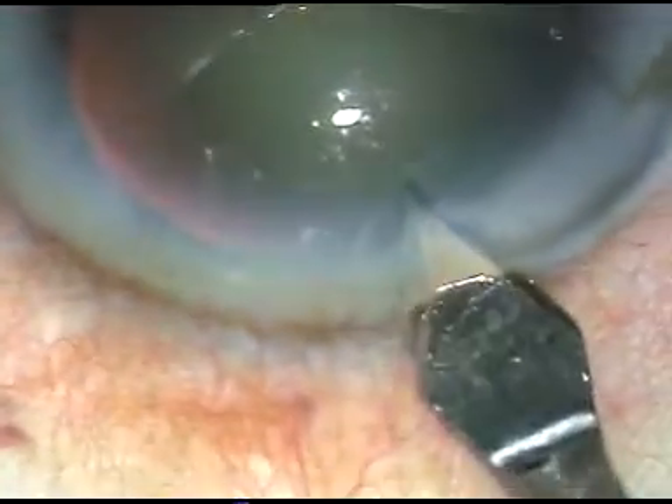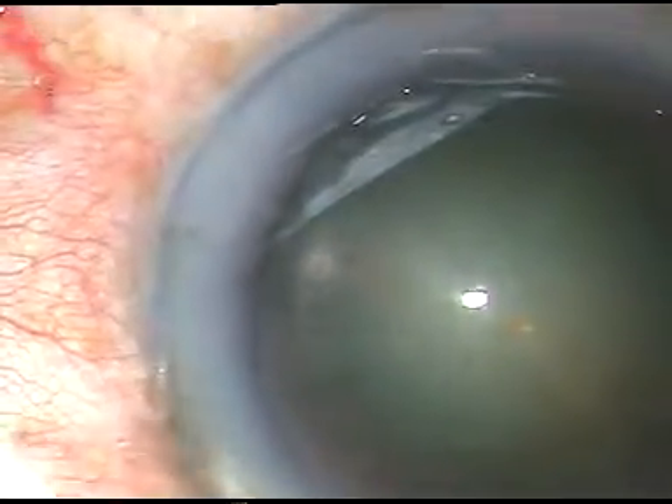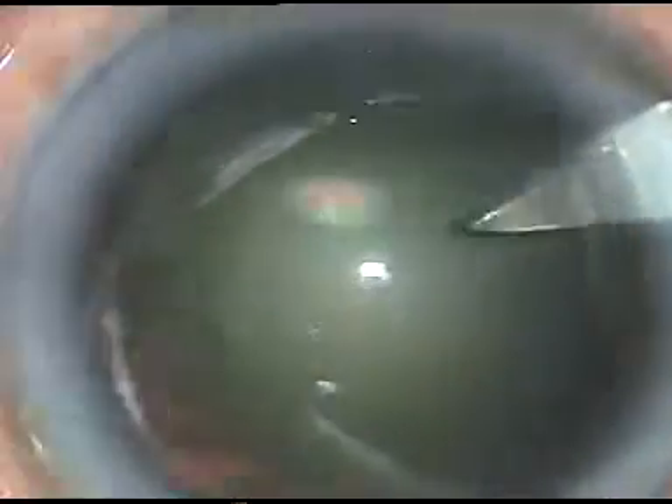This is the main incision. It is a 2.8 mm incision at 11 o'clock. This is a sideport on the right side of the main incision.